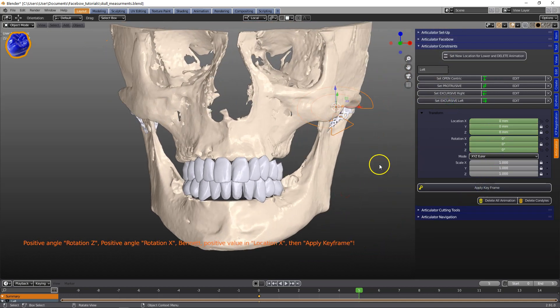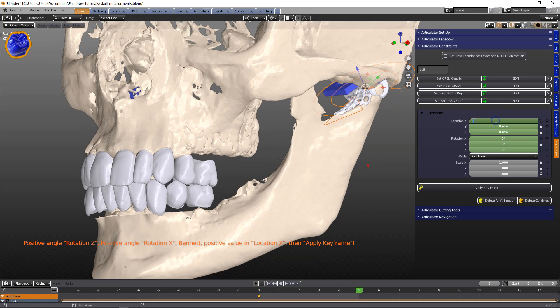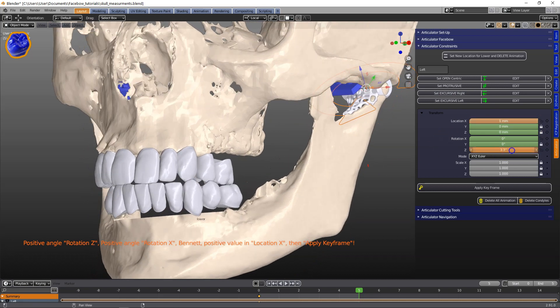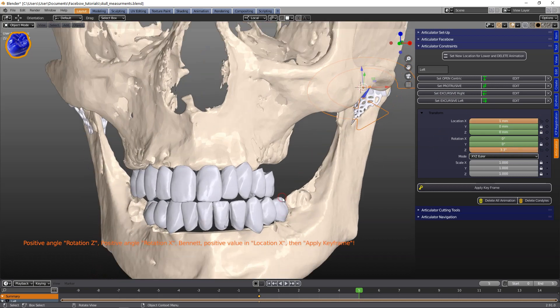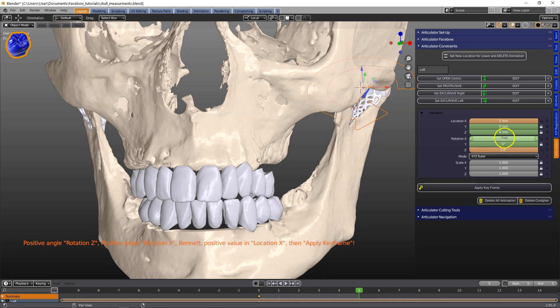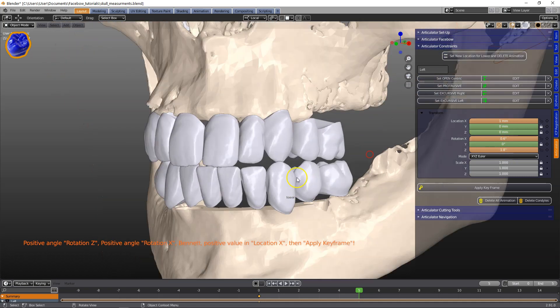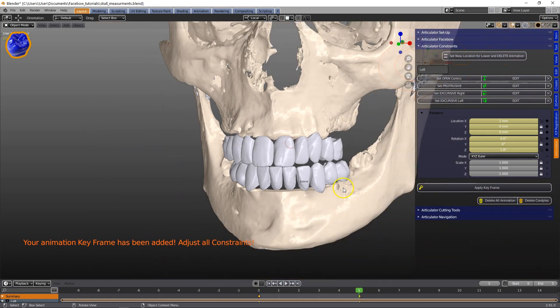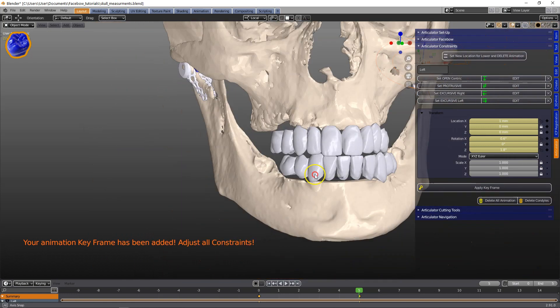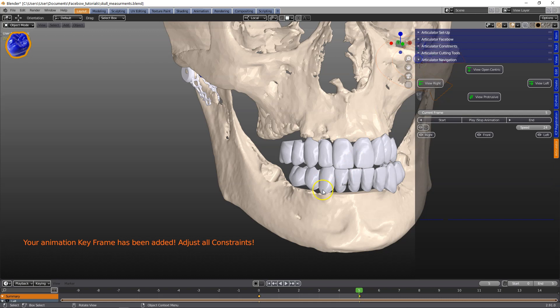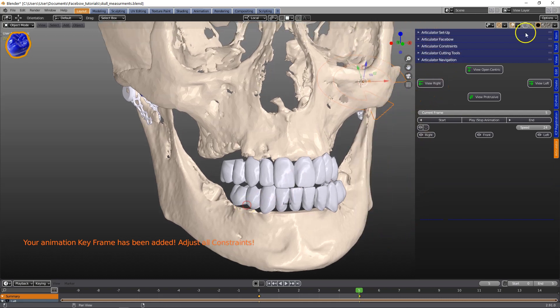Here I'm going to do the excursive left side — we're going to set the Bennett movement, move the jaw a little bit, set it open or closed a little bit as well, and apply the keyframe. That completes the animation.